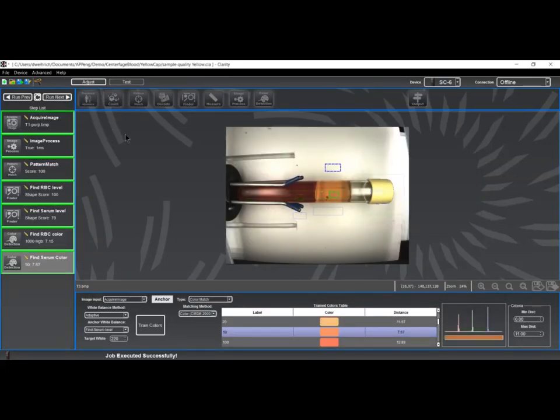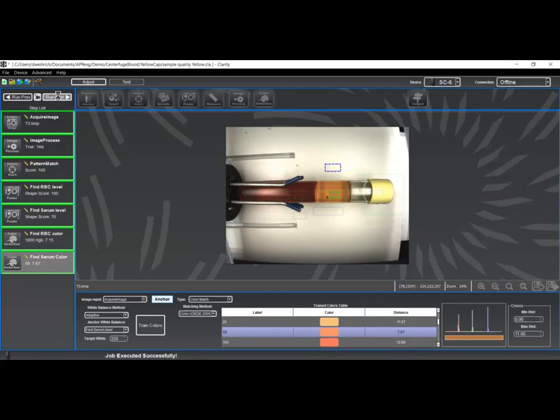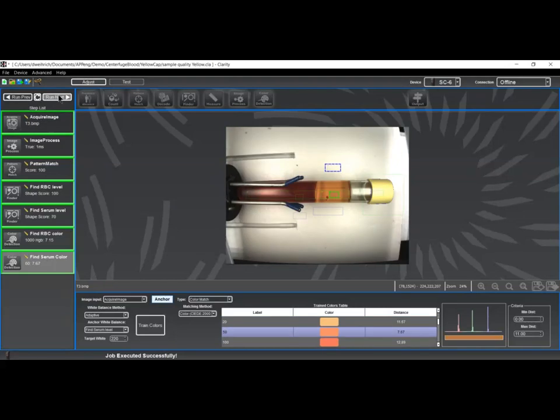I've now added a similar process here to find the serum color. Again, the region of interest for determining the color is anchored to, in this case, the serum level. It's set to be just below the serum level. I also have my region of interest for white balancing, and it's locked to the same index as the same process output as the anchor for my measurement. As I roll through these measurements, I can see that region of interest moves along with the serum level, and also the white balance region of interest moves along as well to match the position of the sample area.